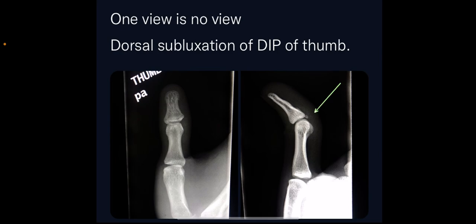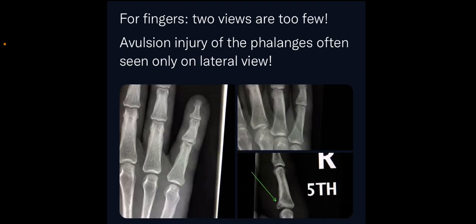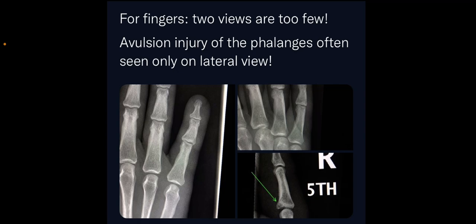Another classic example is the dorsal subluxation of the distal interphalangeal joint of the thumb. On the AP view, you can't appreciate any dislocation or subluxation. But if you see the lateral view, the DIP joint is dorsally subluxated. For fingers, two views are too few. Avulsion fractures or injuries of the phalanges are often seen only on the lateral view. Even if you take an oblique view, these avulsion fractures can be missed.